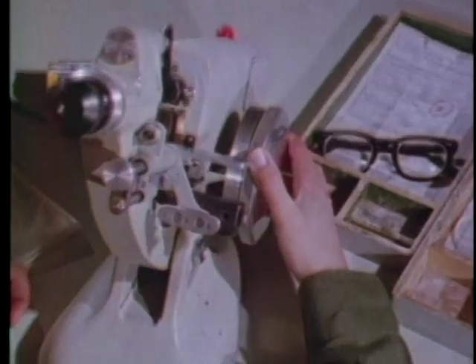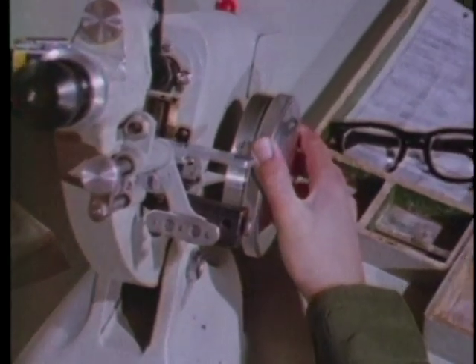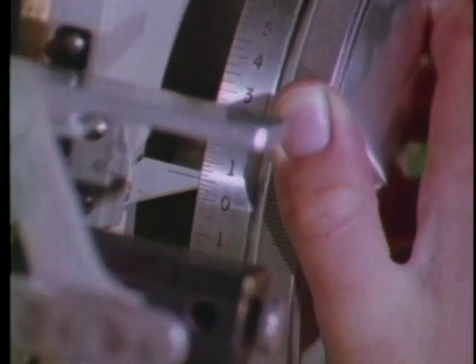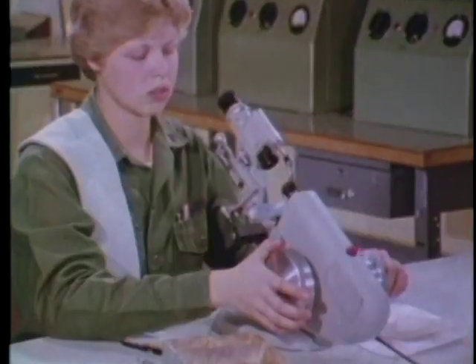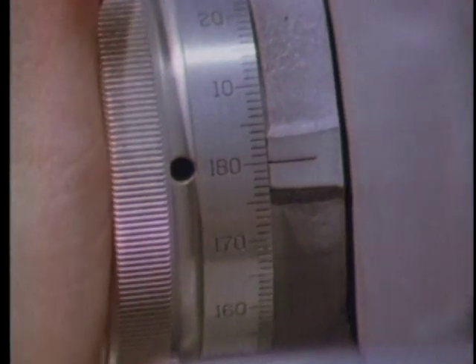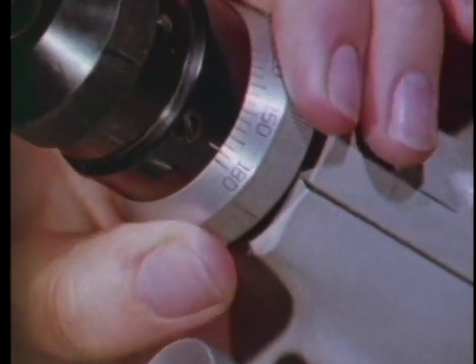When you use a Vertometer or a lensometer, the first steps are to set the power wheel to zero, the axis wheel at 180 degrees, and the prism axis indicator at 180 degrees.